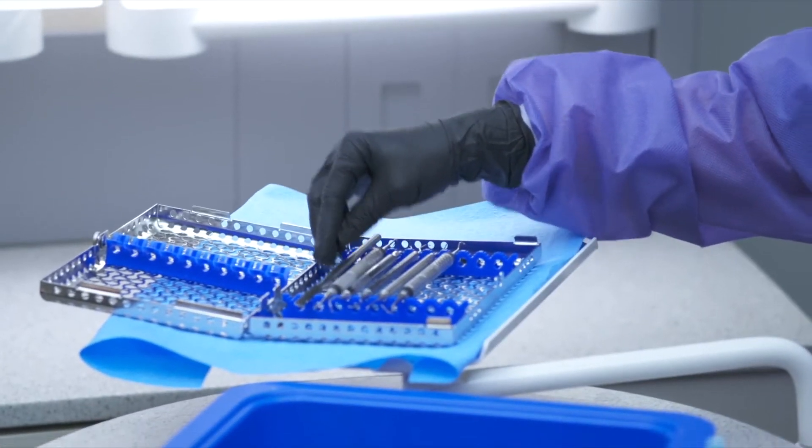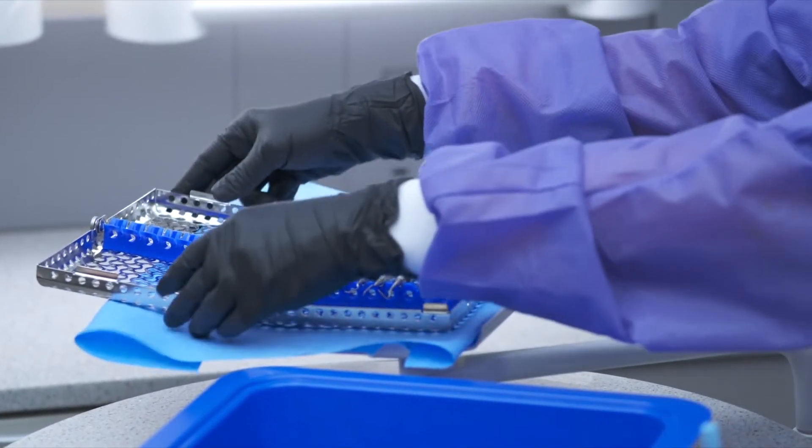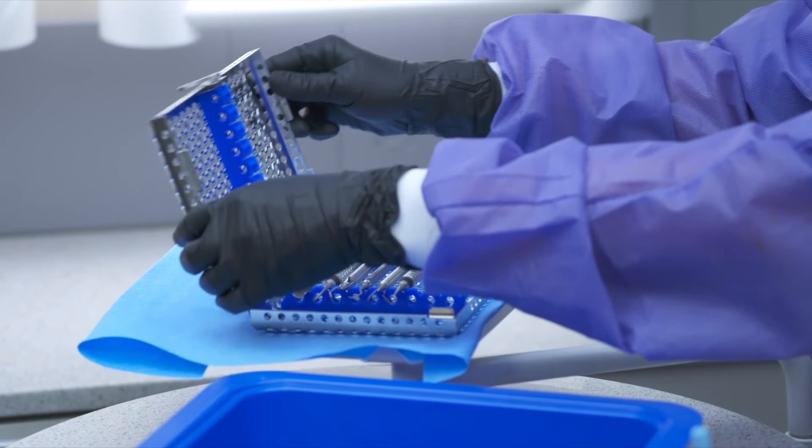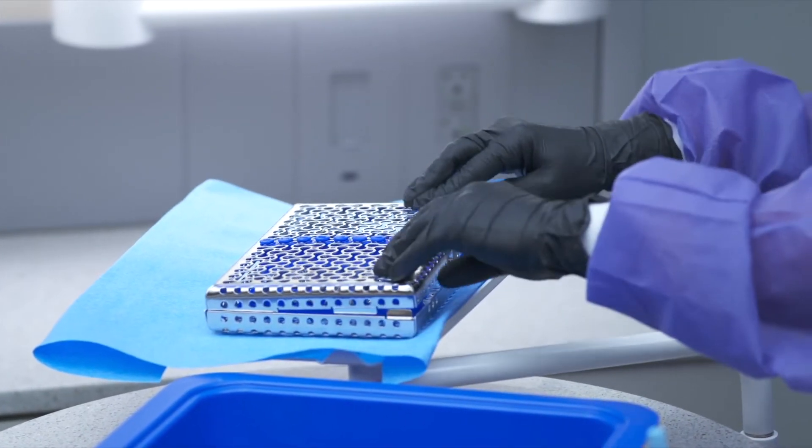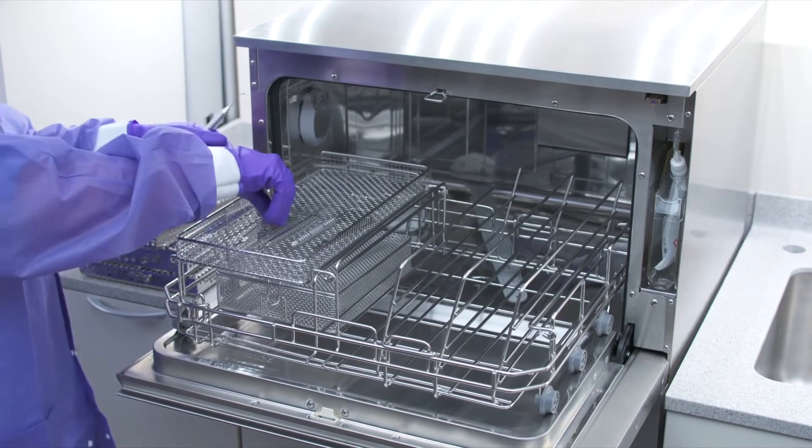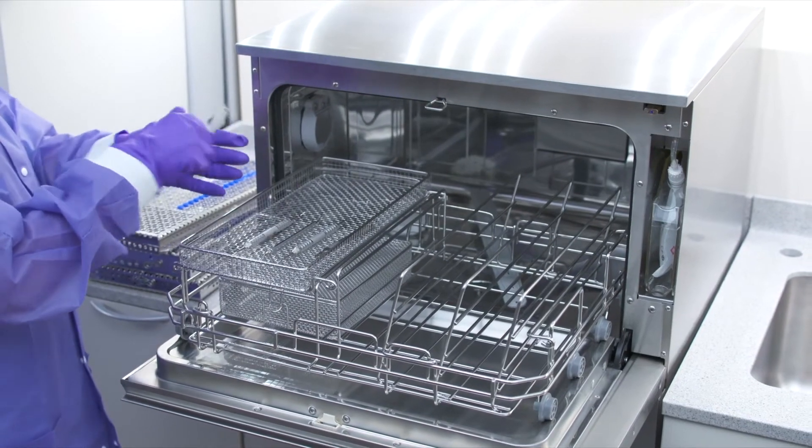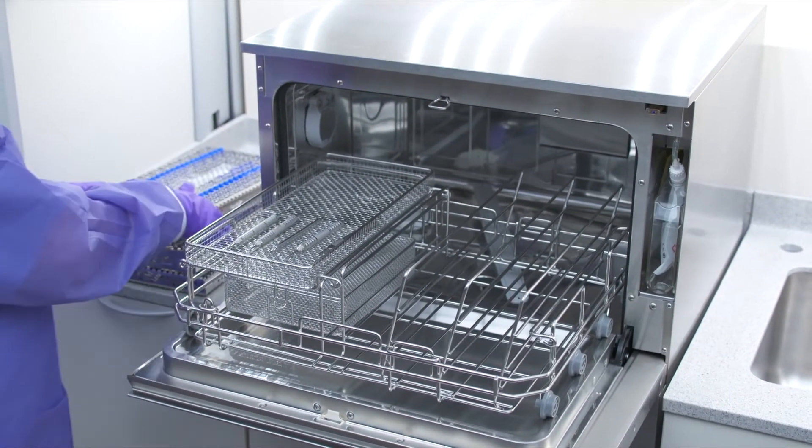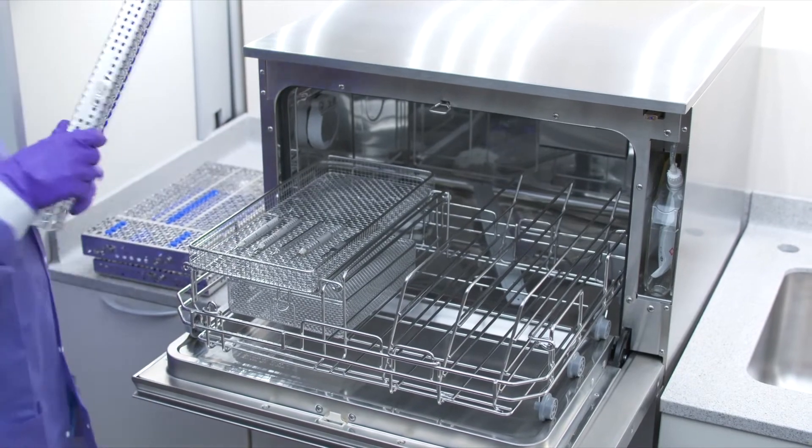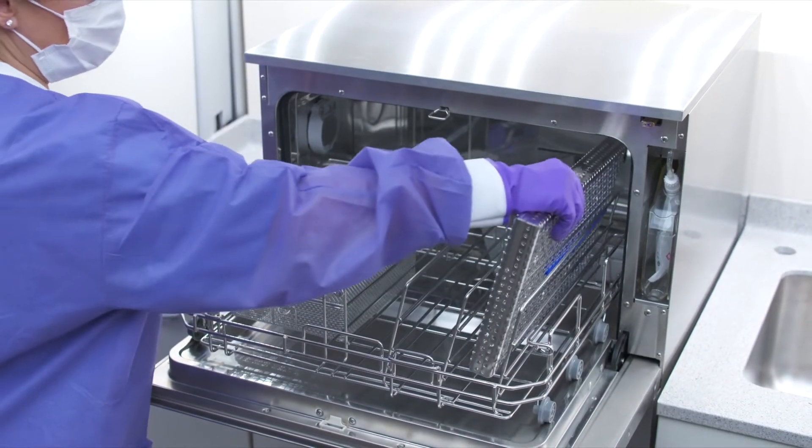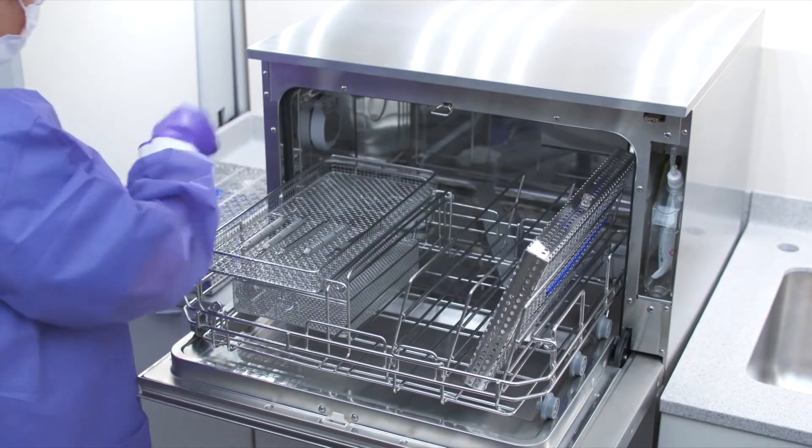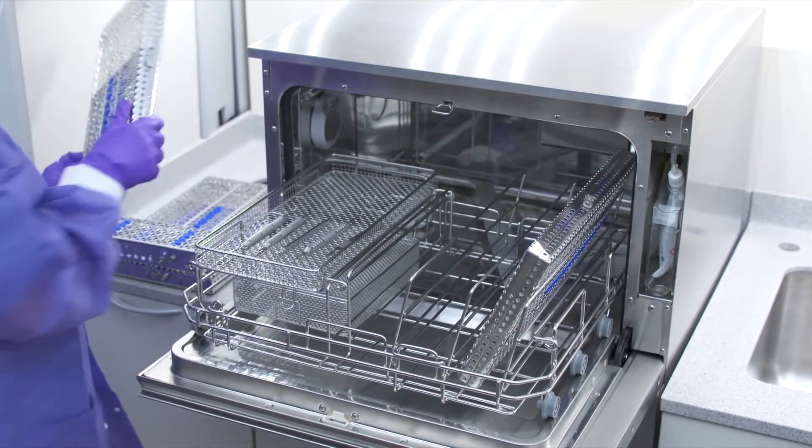Depending on the type of instruments, place them either in instrument cassettes or in one of the baskets that came with your Hydrum. Place trays and other concave shaped items at an angle to ensure water can run off surfaces easily.